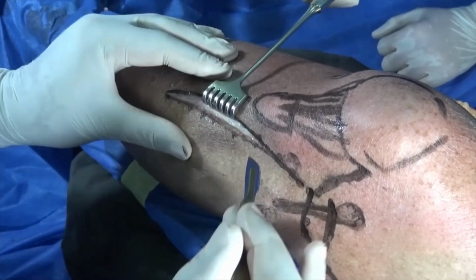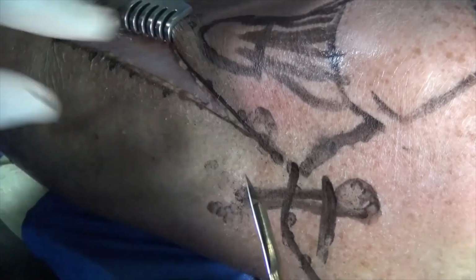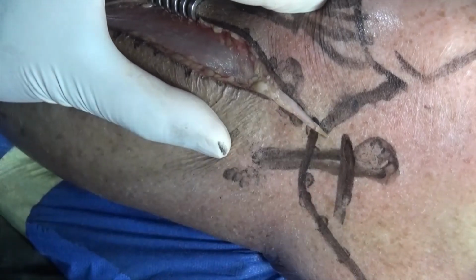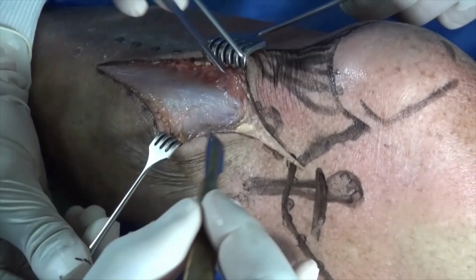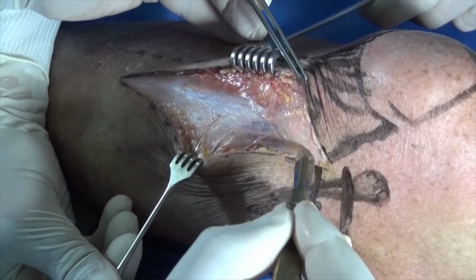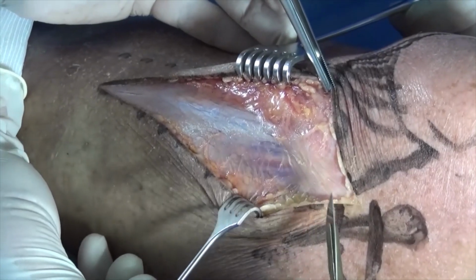So I'm making my incision towards Gerdy's tubercle, and I've marked here the joint line of the lateral femoral condyle, and for this part of the approach, I'm going to stop here. I need a pair of fine forceps, which is here. And you can see the crural fascia, which continues up here into the iliotibial band, which you can see the fibers sweeping down here. Can you see that?